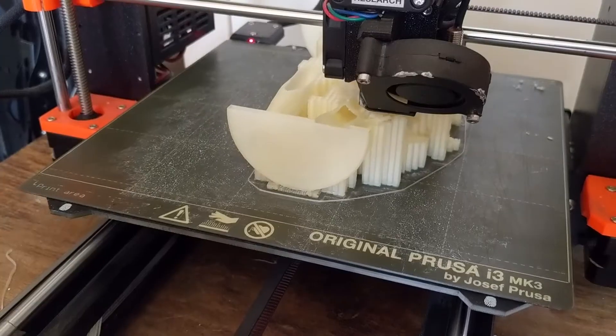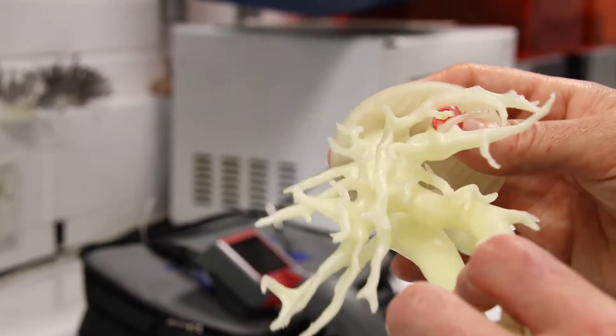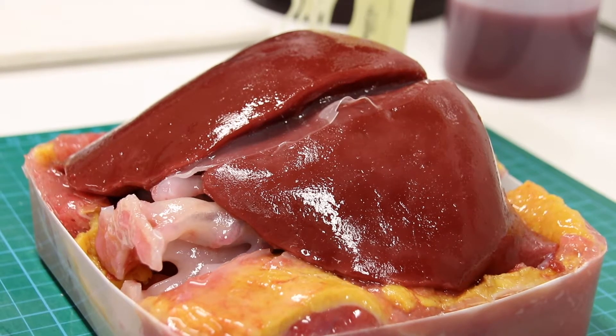Even rarer still is that they'll 3D print one of those, but what we've done is taken the 3D prints direct from the patient data and transformed those into a tactile, palpable organ which is able to be used for surgery.